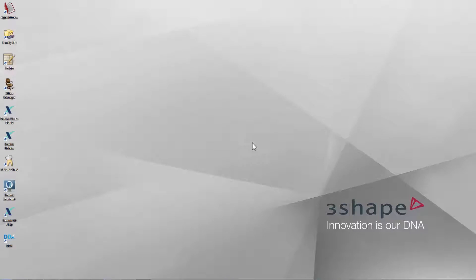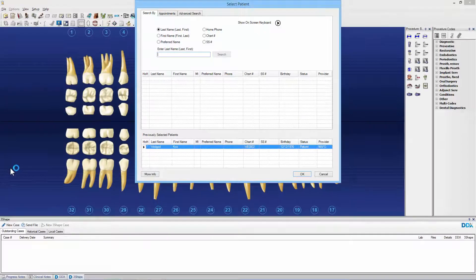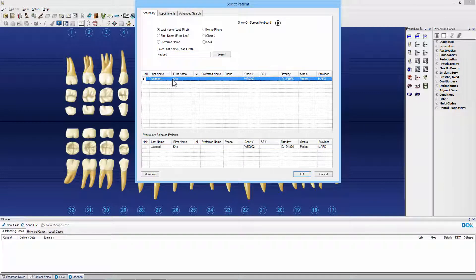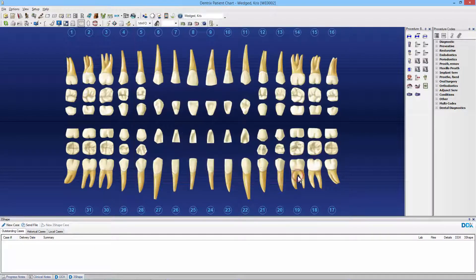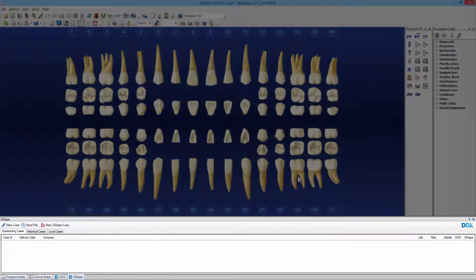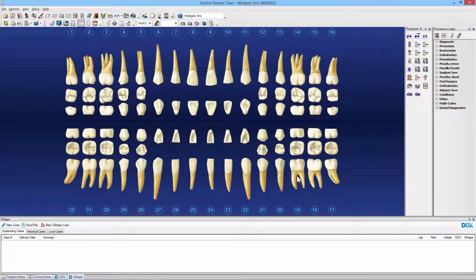While in Dentrix, go to the patient chart. Search for a patient that you want to scan. Select him and click OK. Notice the embedded 3Shape panel in the chart. Press New 3Shape Case.